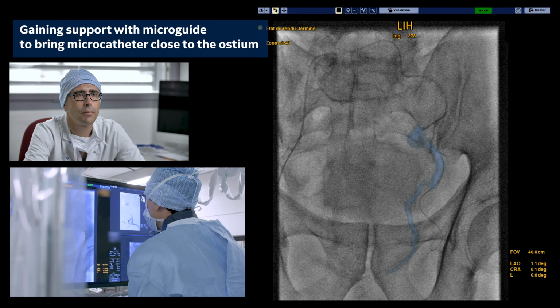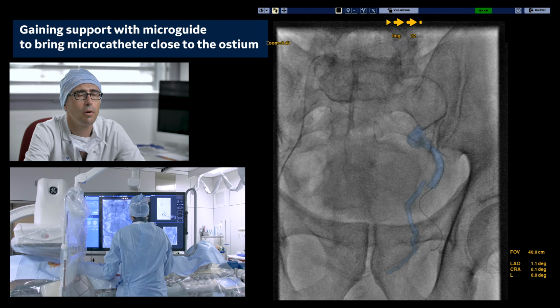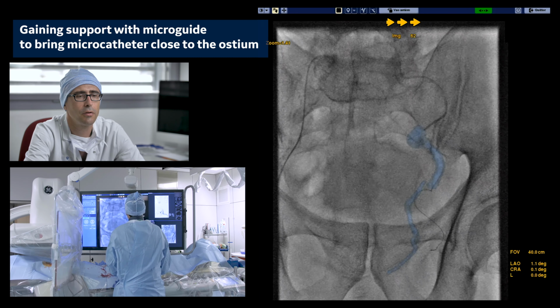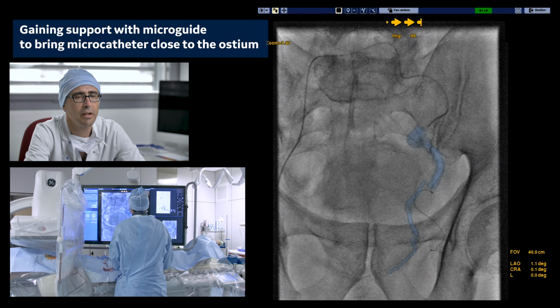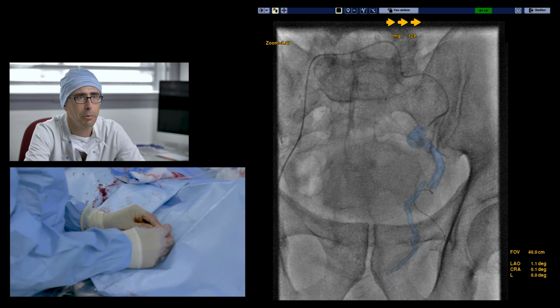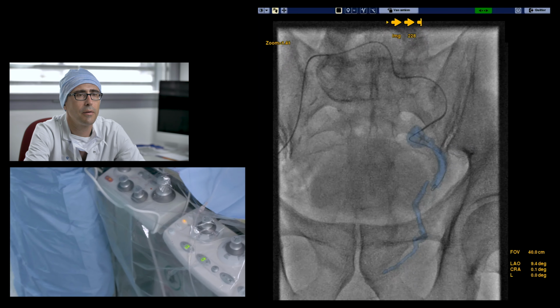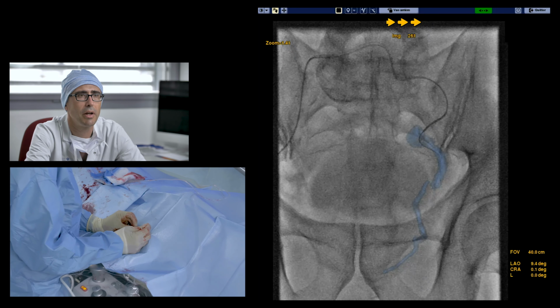The GE cone beam CT provides high quality image. We are also very familiar with the use of the software and also the remote control on the table of the CBCT. The software allows us to navigate in the arteries, and we are using currently Embo ASSIST. And in some cases, we are using the digital zoom and also motion freeze.